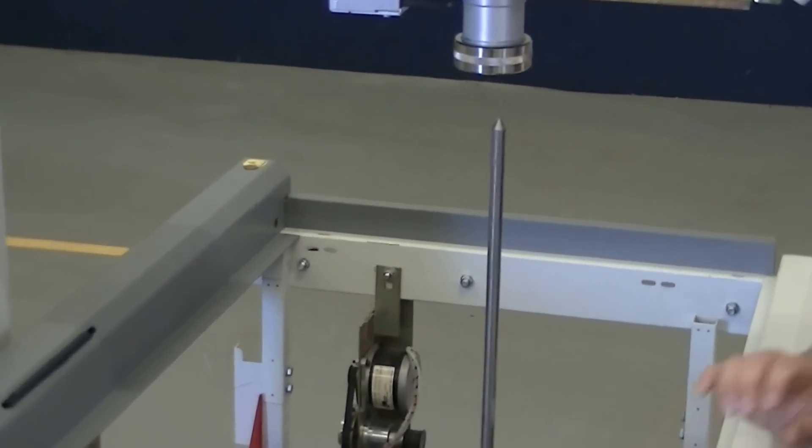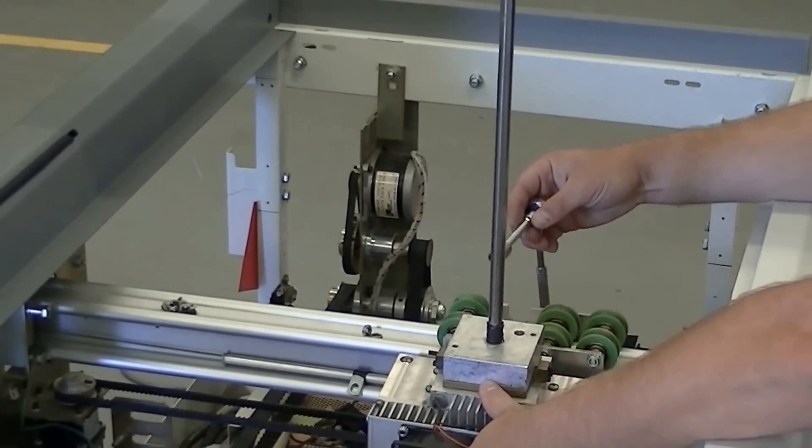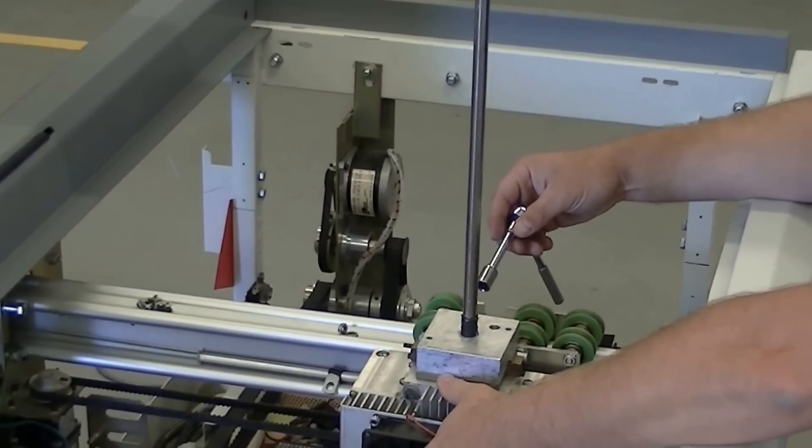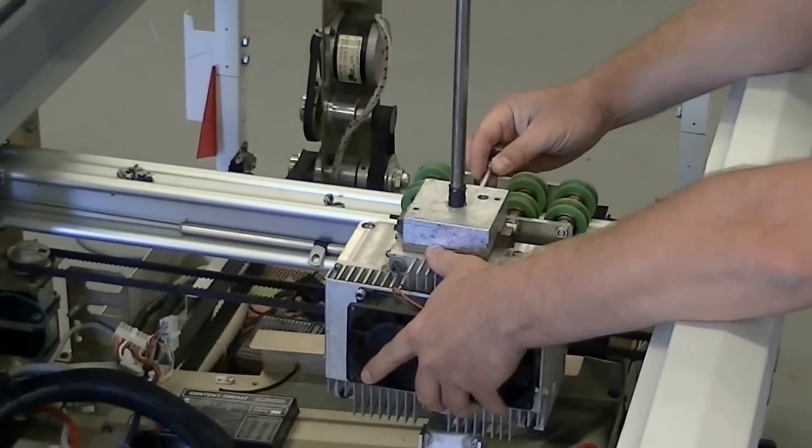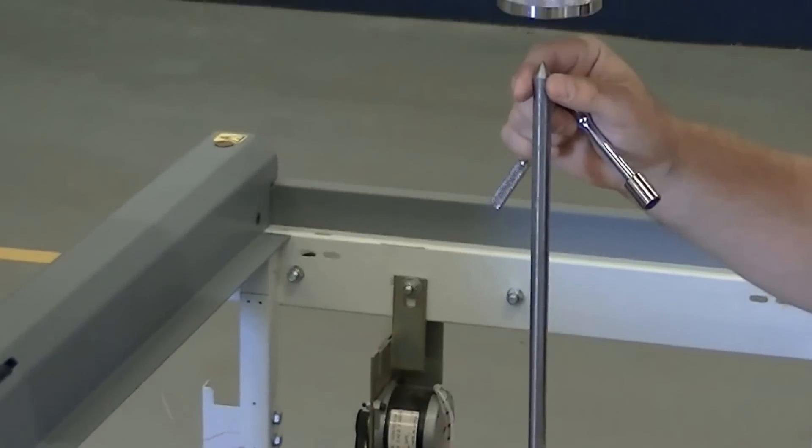So once you have the alignment rod secure, you will then grab with your left hand the tube and there will be a balancing act, trying to get this point of the alignment rod into the bottom of the detector.